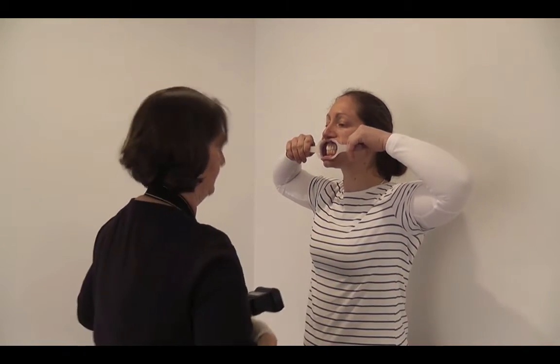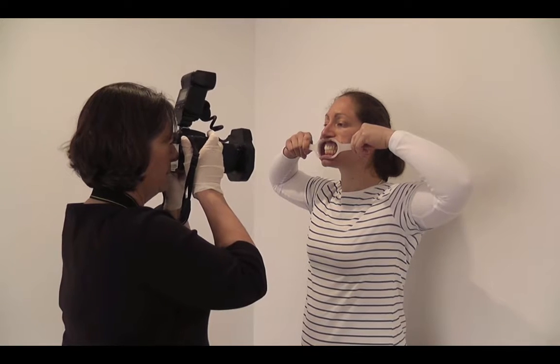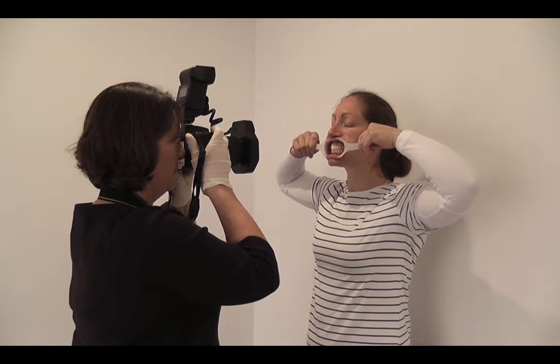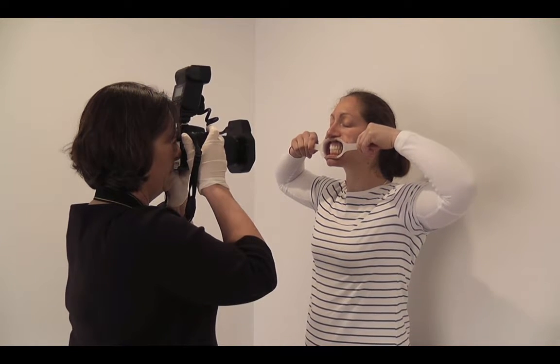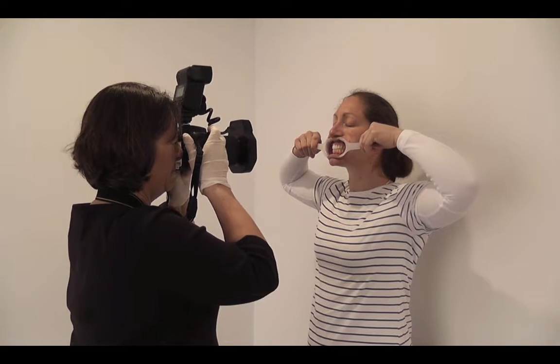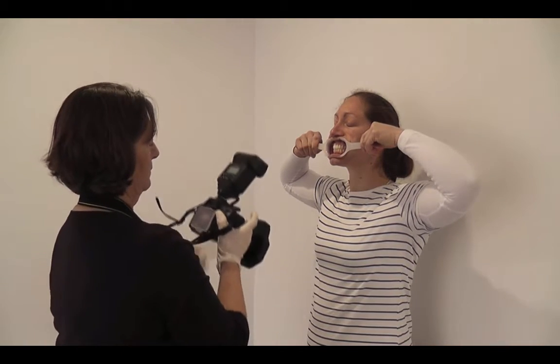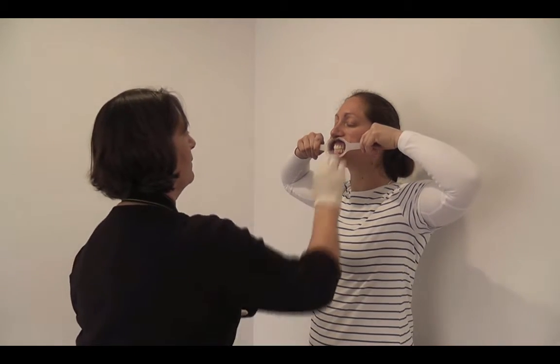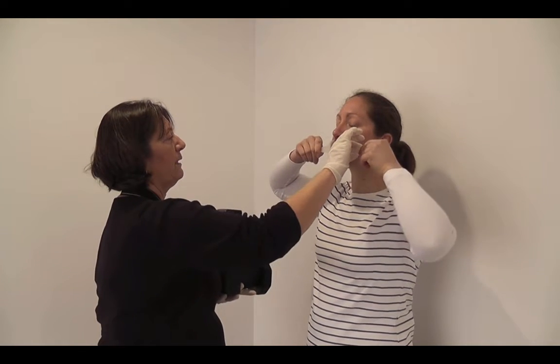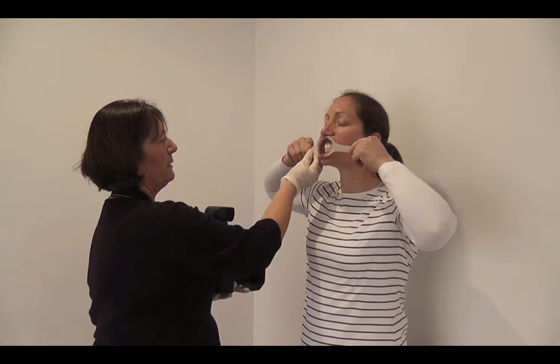Firstly, take the anterior view with the patient biting in normal occlusion, with cheek retractors stretched as far as possible away from the teeth and gums, allowing a good clear view of the teeth. You want the whole arch in focus. Make sure that the patient is not tilting the head so that the mouth and occlusal plane is horizontal with the floor.